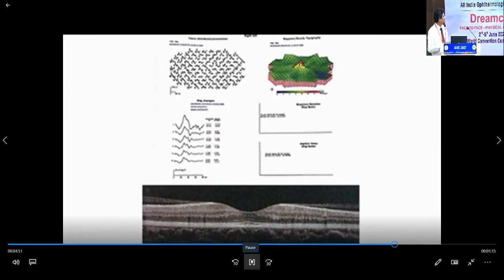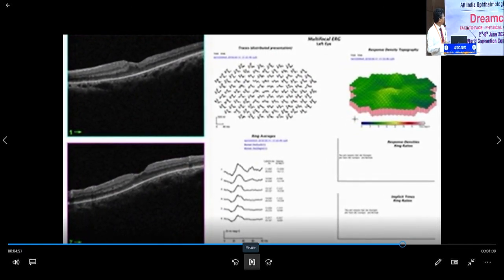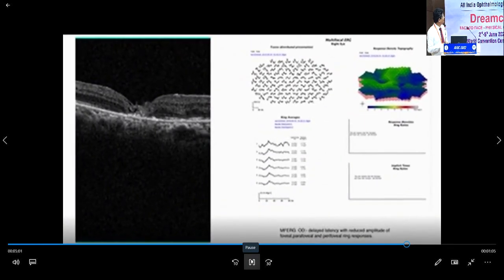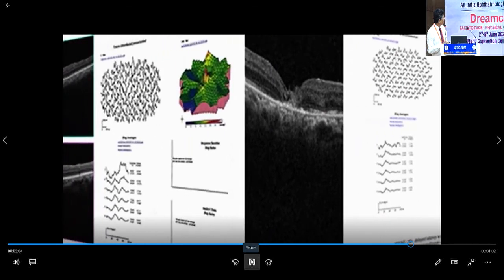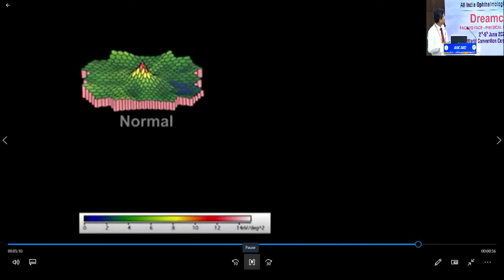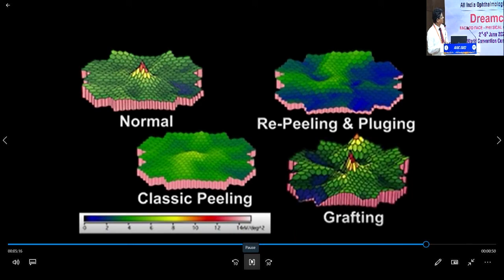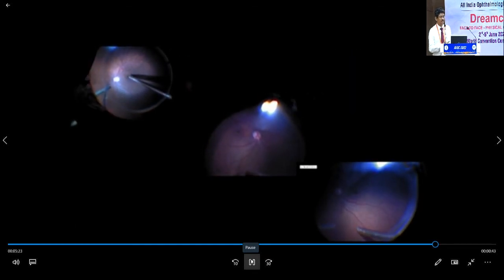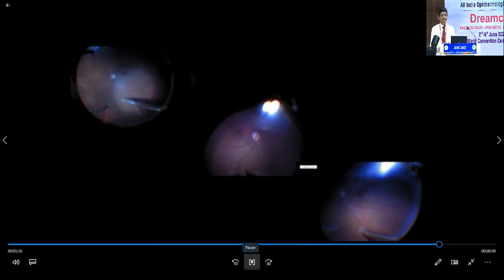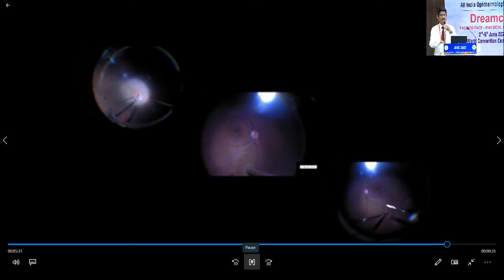Let's have a quick look at how multifocal ERG behaves in different scenarios. This is normal multifocal ERG. This is MFERG in a standard ILM peeling case with hole closed. This is ILM peeling with plug. And this is the retinal graft case. On one page: normal, classic ILM peeling with hole closed, re-peeling with plugging after failed surgery, and grafting after failed surgery. We have very limited number of cases, but once you are stuck, retinal transplant is a way forward to look into. Thank you.